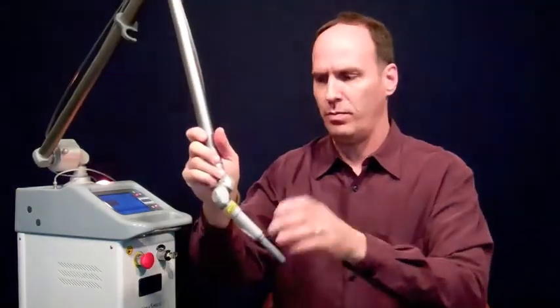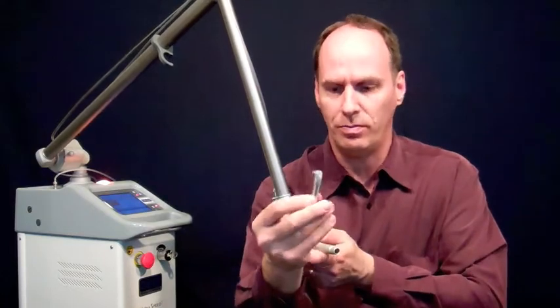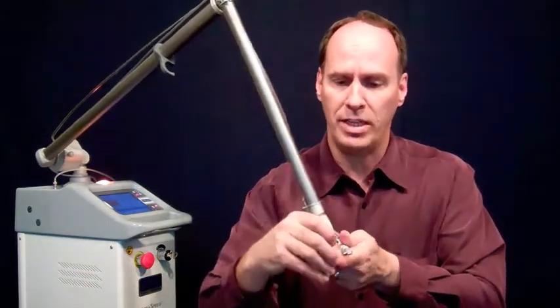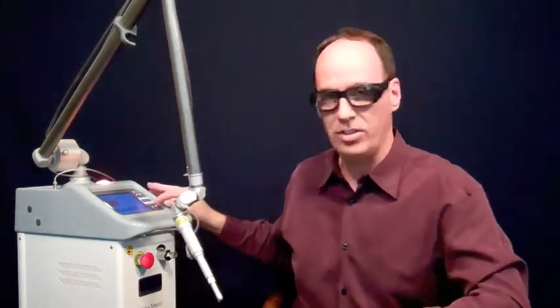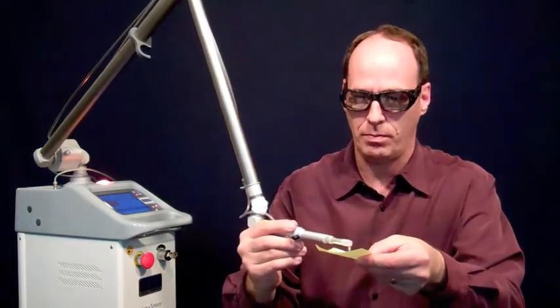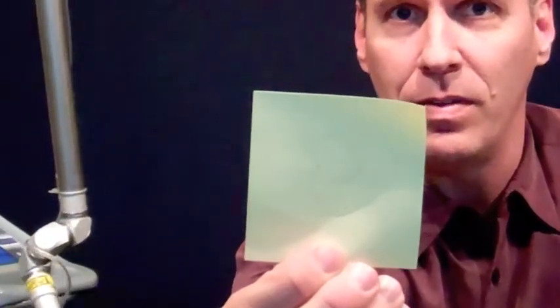Now that we've covered the safety procedures regarding the laser, there's just one thing left to do, and that is to test the laser out prior to its first use. Simply remove the arm, insert your perio insert, tighten it down, insert a perio tip into the perio insert, grab your goggles, turn the laser on, and run the perio tip along the surface of a post-it. What you'll see is a line, which if you hold up to a light source, you'll see is made up of small holes. If that's the result you get, your laser's ready to go.